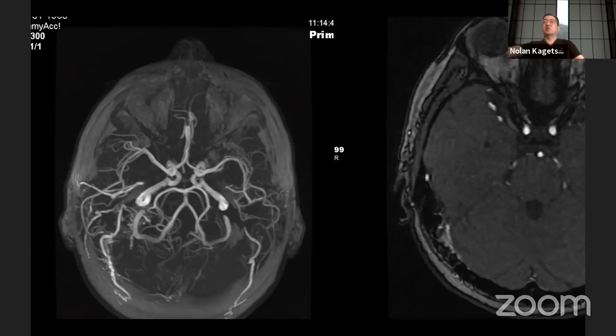And so MRA is kind of a cousin of MRI. One of the interesting things with MRA is that we use tricks to get signal from the flow without using contrast. A lot of even junior physicians think, oh, MRA, we have to give contrast. And the thing with contrast is that sometimes people have allergies, or it's just one more step. Before MRA, to get an image like this, you had to stick a catheter in the blood vessel, typically the groin, and inject contrast. The patient had a risk of stroke. So MRA has been actually pretty cool and revolutionary. It came to be in, I would say, the 80s, and we were first learning about MRA. I'm lucky in that I got to see MRA essentially from the first time it was introduced, and have seen it evolve.